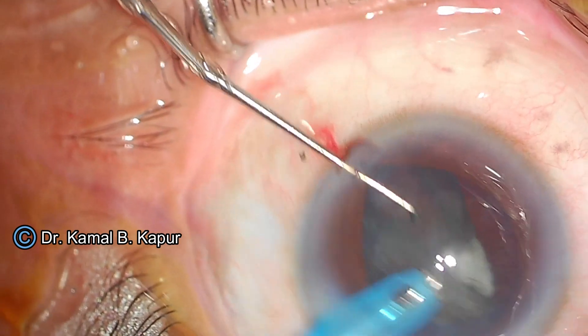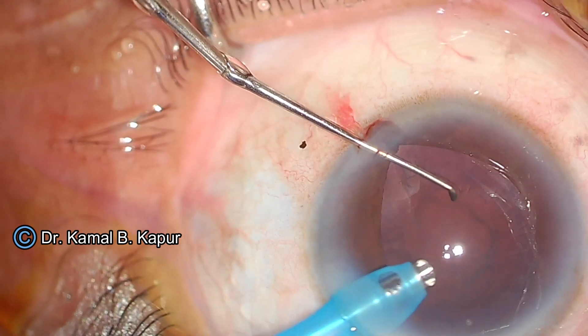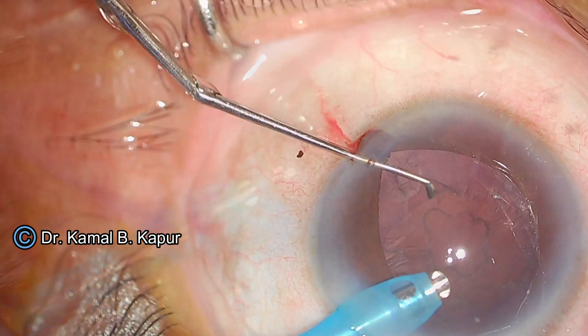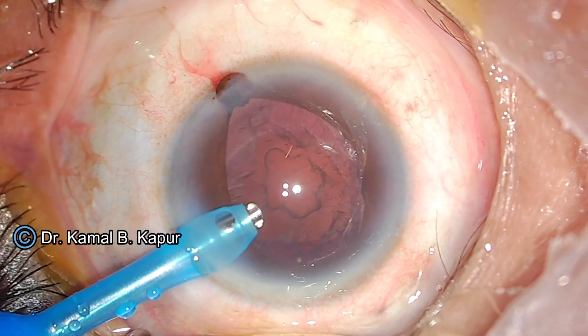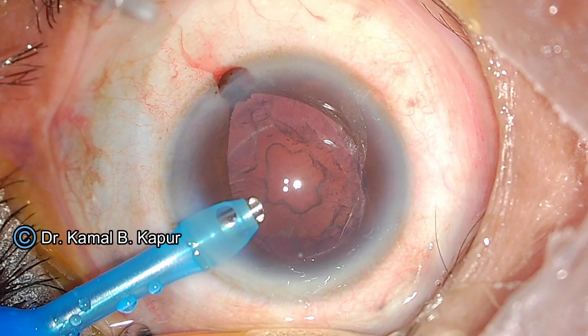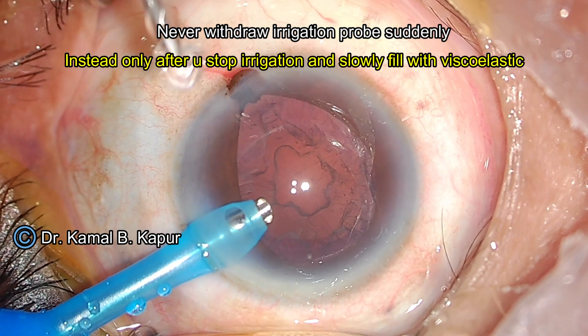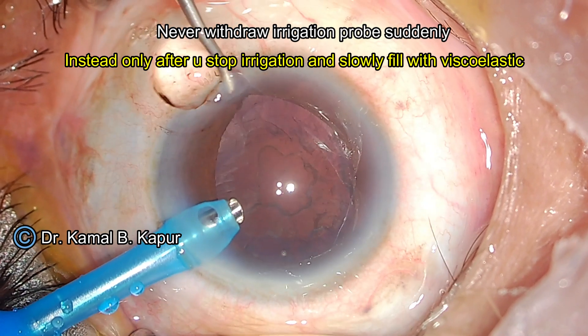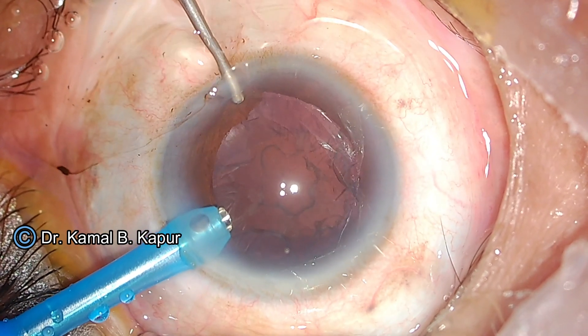Now I slowly aspirate the complete cortical plate. Once the cortical plate is out, you can see the area where there was a posterior polar adhesion. If you notice very carefully, there is a linear opening extending from one edge of the equator of the capsular bag to another.